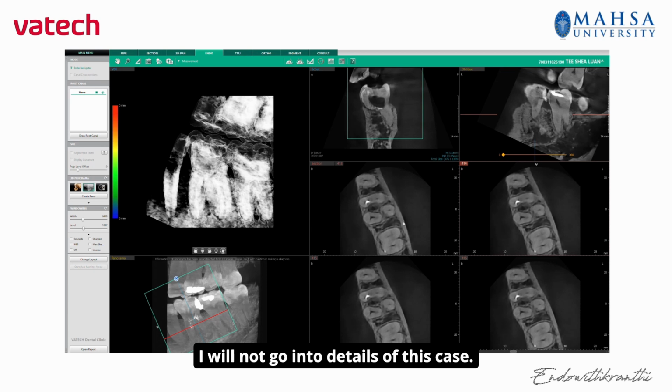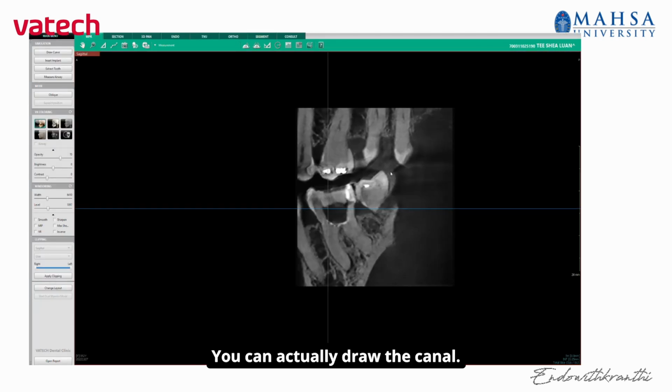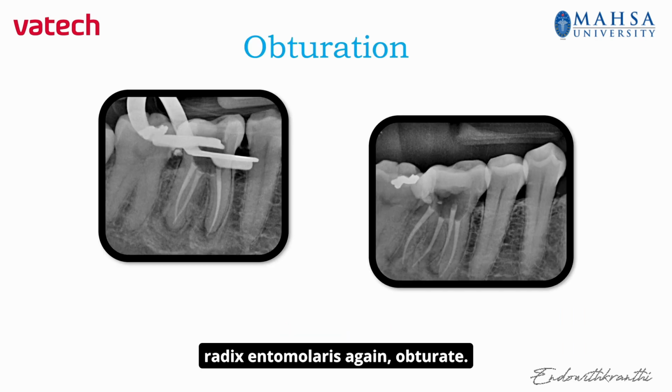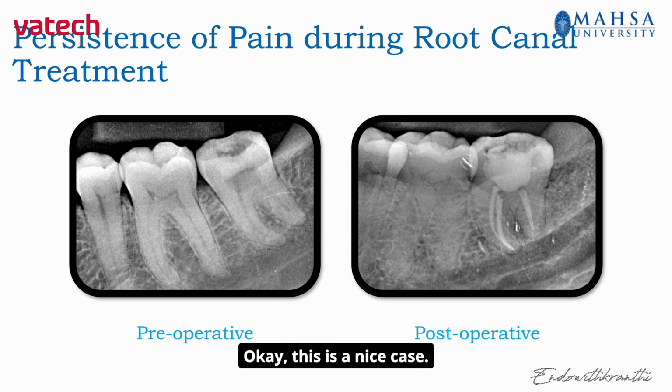Similar, I will not go into details of this case. Same thing, you can actually draw the canal, you can profile it well, you can clean, you can shape, radix entomolaris again, obturate.